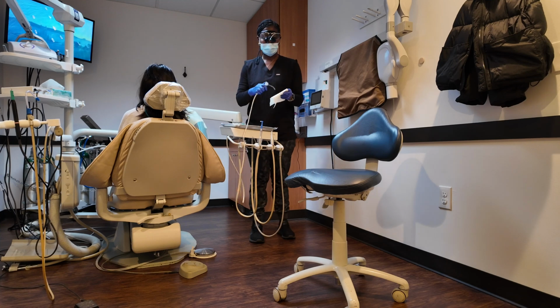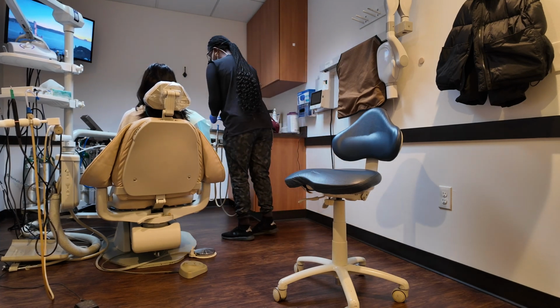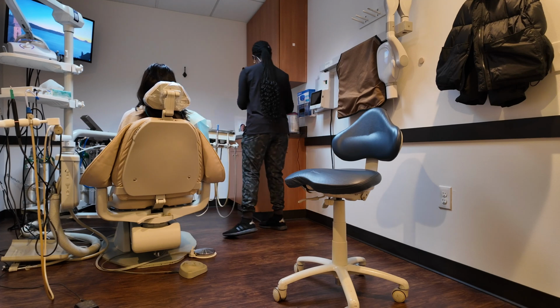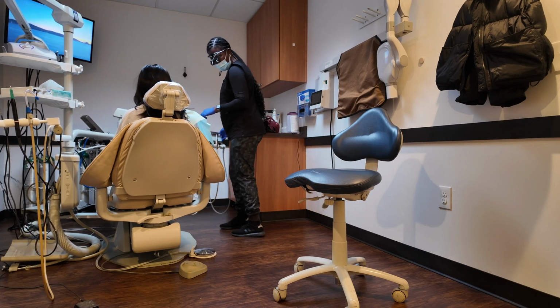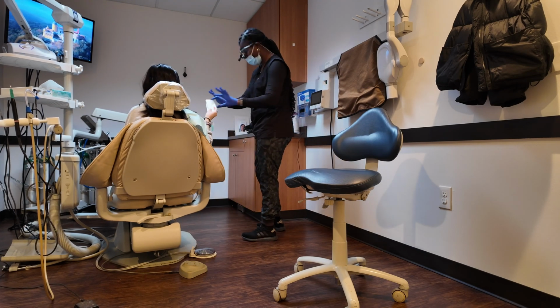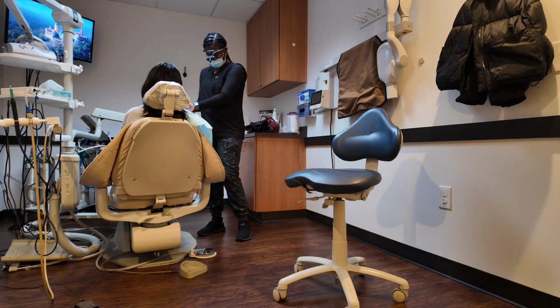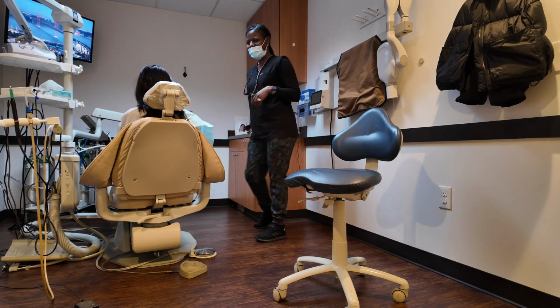Sometimes I'll also give them a little bit of Listerine. Make sure that you're using zero alcohol mouthwash no matter what. But then I also like to give them a damp napkin just in case, so they can wipe off their mouth and get all of that grit and all of that feeling out of the way. Once I'm done, I always like to ask if they have any questions before I go and grab the doctor.